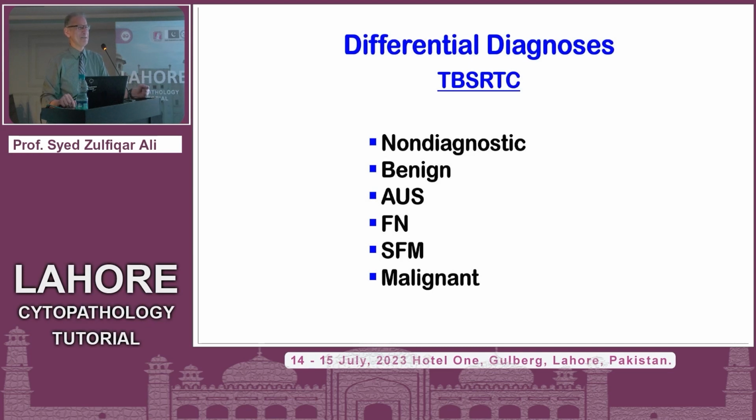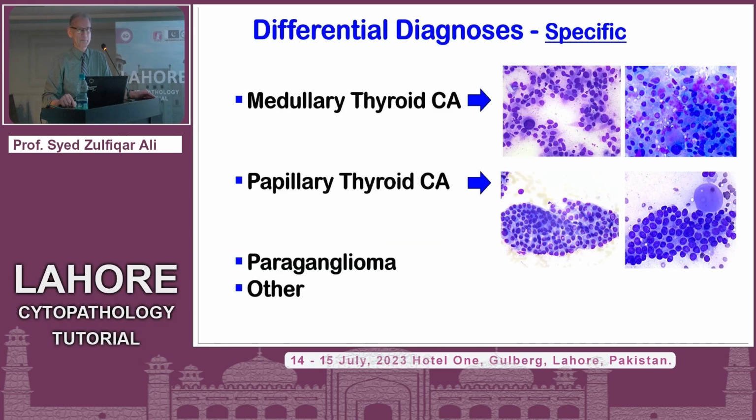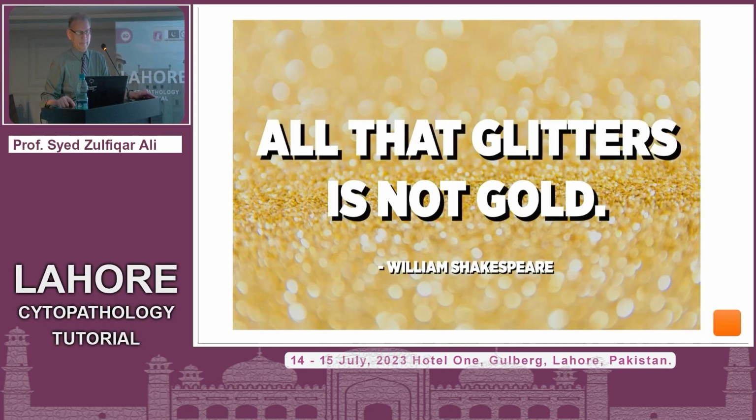They are so confident. They will hate me after this. So medullary thyroid carcinoma is the number one differential here. Beautiful intranuclear inclusion and amyloid. Not our case, but differential diagnosis. PTC, we already showed, saw a lot of cases, paraganglioma or some other lesion.